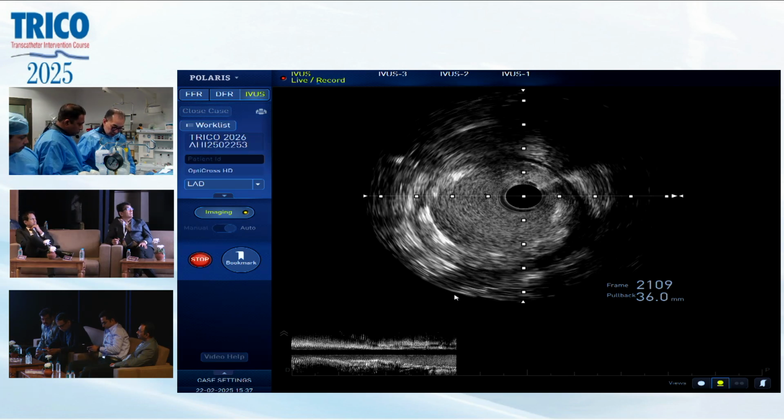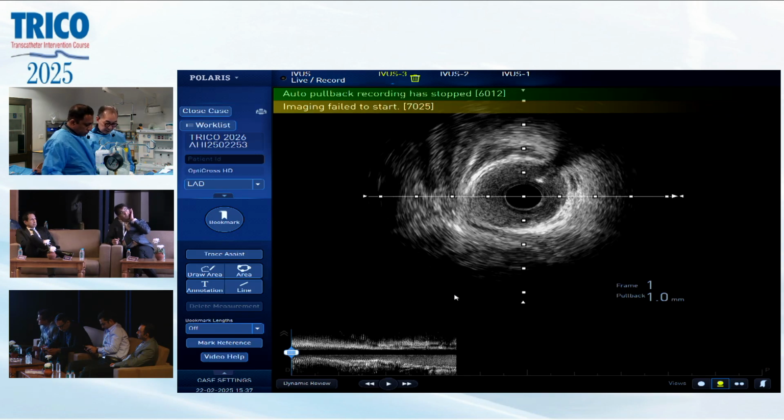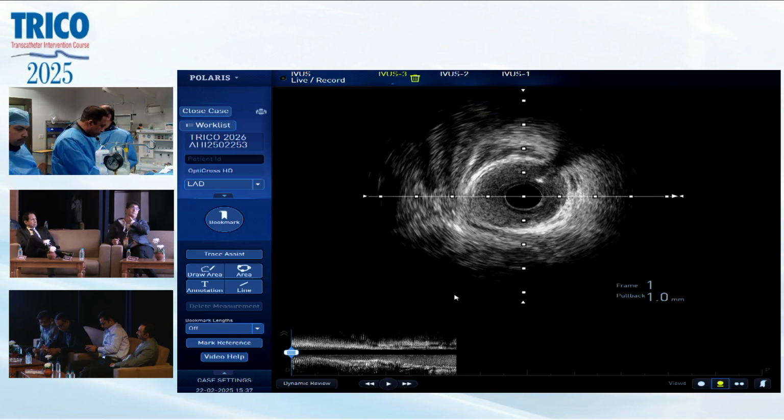Let me recourse the Y. Let me get another one through Y. We might need to do the IVUS for the side branch to see, or we do an IFR, exchange an IFR later on. So can I have another one through? Give some nitro. Run through wire. So what do you think, if I do the IVUS for the side branch, is it helpful?